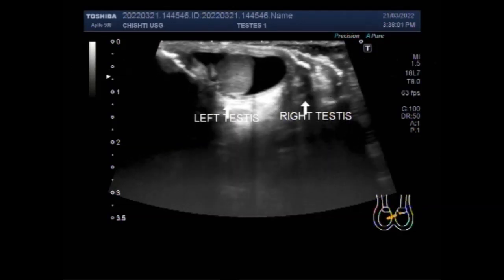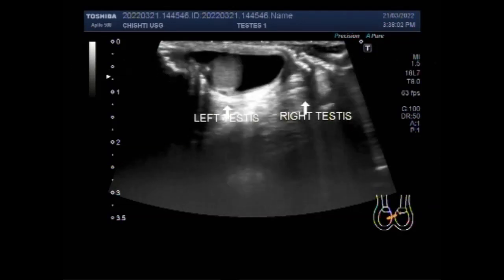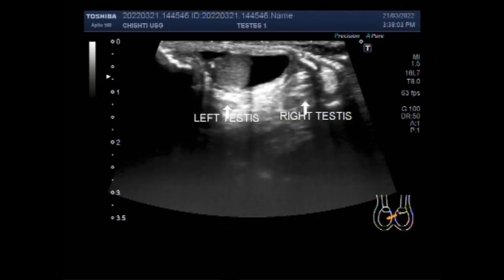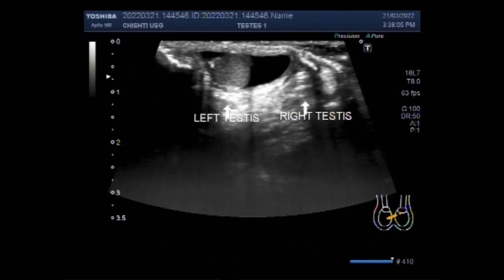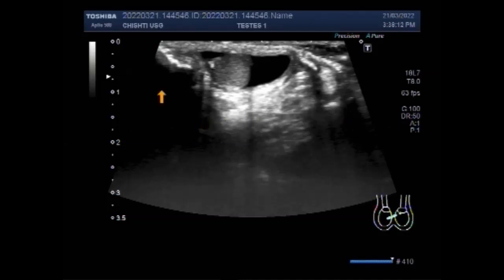Now the ultrasound findings in the inguinal hernia are: herniated gut loops along with some fluid collection at the inguinal region on the affected side, and testes and epididymis pulled up with the herniated contents.